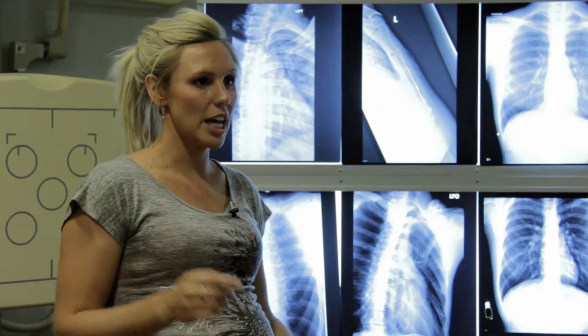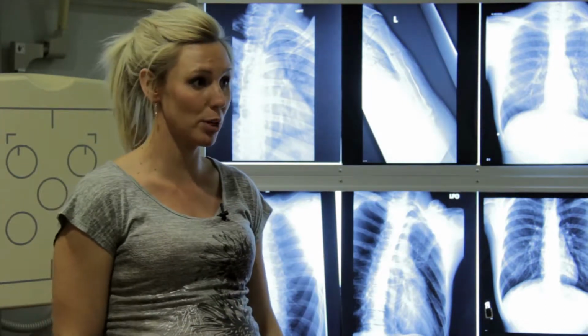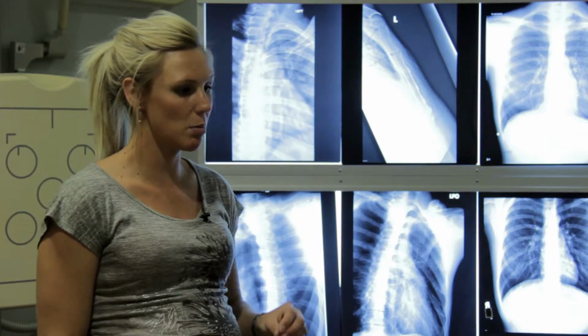In room 3, take off the servo. Put the table down, raise the tube up. You'll get pretty close in room 3. You can get some distance in there. But we still want to maintain kind of that 72 inches. So even if it's not possible, use as much as you can. Okay? Use as much distance as you possibly can. So that's kind of the fourth rule for lower ribs, is absolute maximum distance.